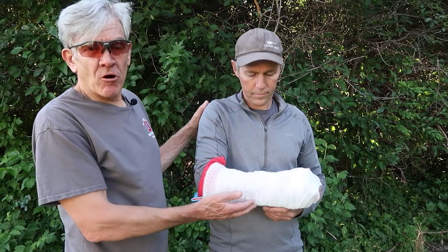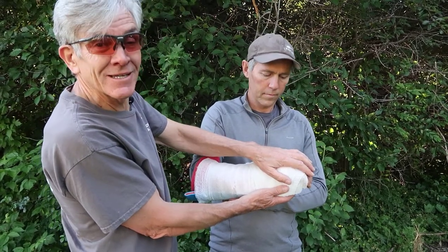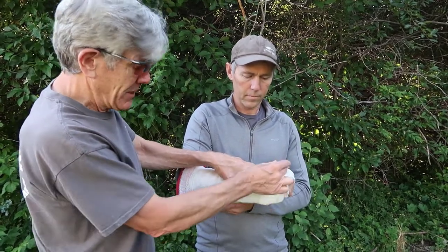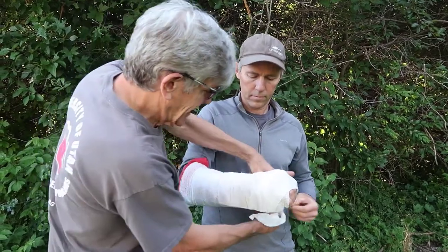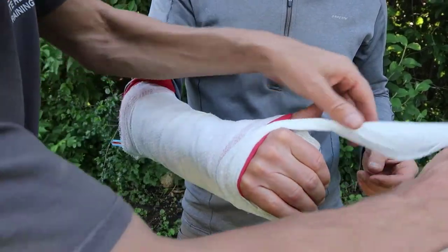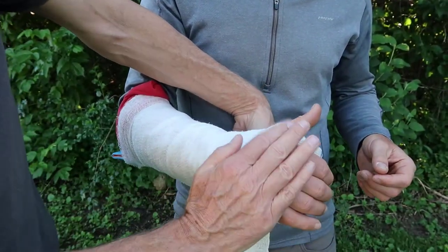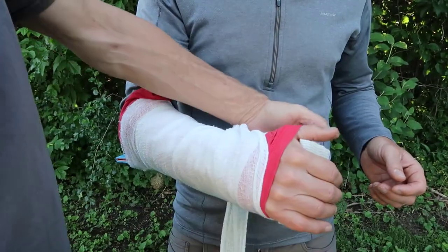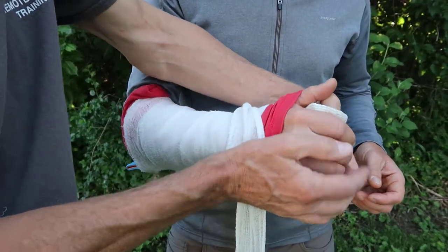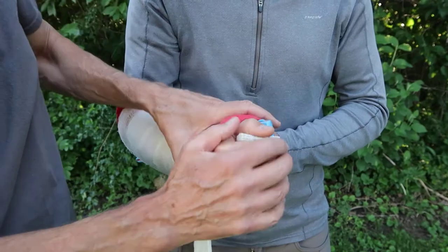Here we've splinted a forearm injury using a SAM splint. A key part of supporting the forearm is ensuring that the wrist can't move — if you do the motorcycle throttle movement, we're trying to reduce that by trapping the knuckles. I've gone around his knuckles; it's helpful to create a little twist as you go between the web of the thumb to reduce the material there, and then trap those knuckles. Without trapping the knuckles, you get wrist flexion that causes a lot of pain. You can also see we've put a roll — could be socks — inside his hand to trap it in position.